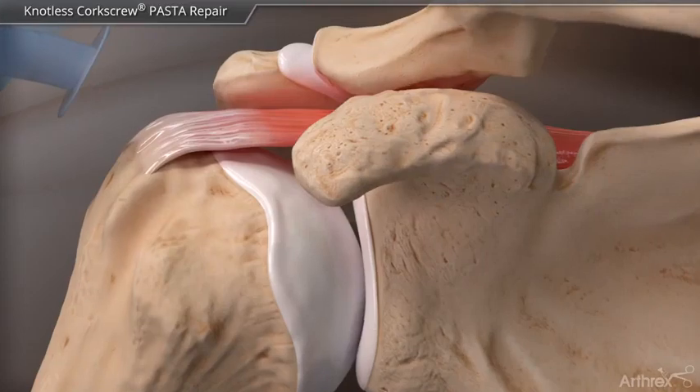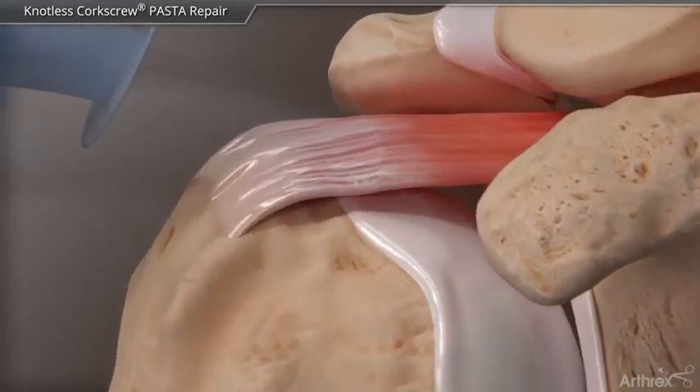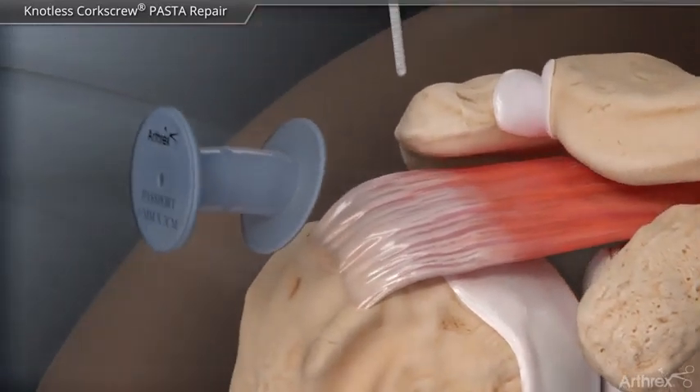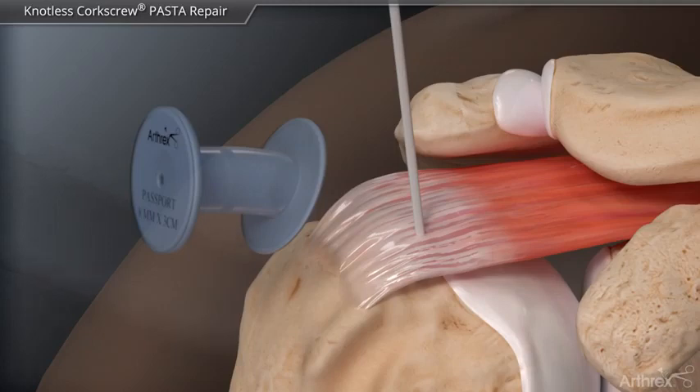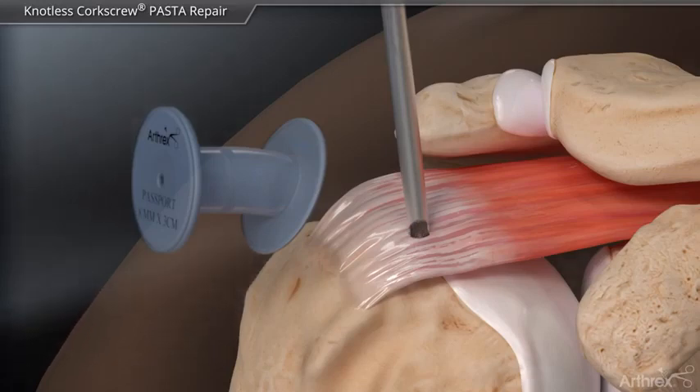The pasta bridge uses double row fixation with one lateral and two medial row anchors. The use of a spinal needle and dilators helps protect the supraspinatus tendon and articular cartilage. The anchor is inserted percutaneously with a system of steps to dilate the soft tissue, allowing the insertion guide to easily pass through the tendon for anchor placement.